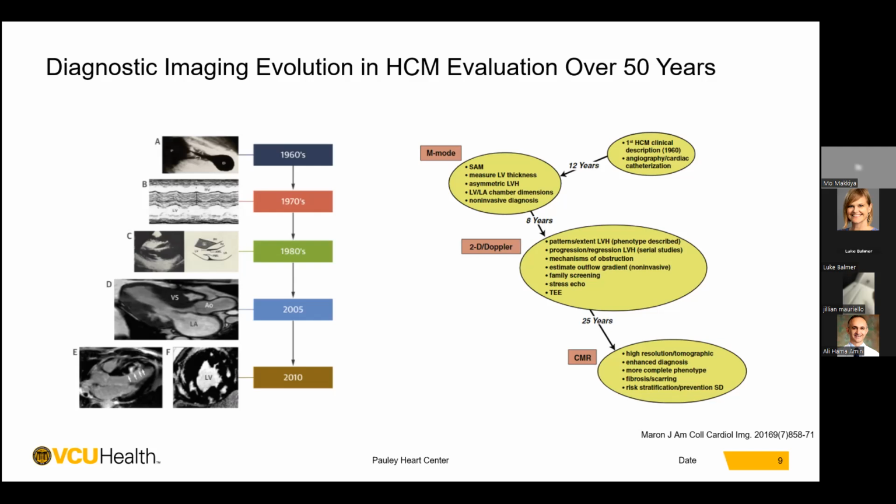Then in the early 2000s, the first generation MRI, the workhorse for evaluation of the heart dimensions, came up and was utilized to evaluate the heart.